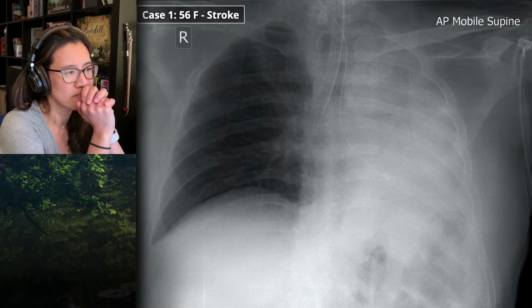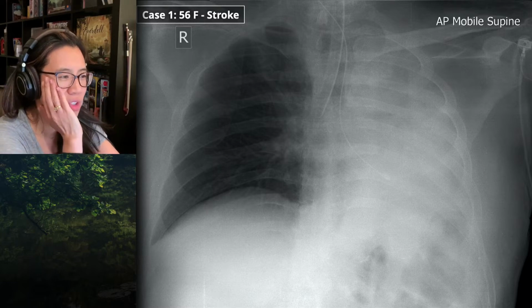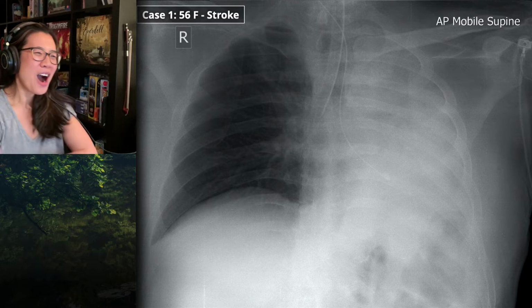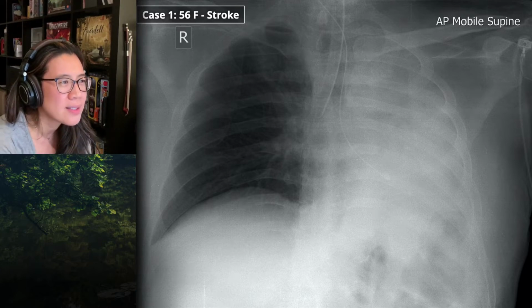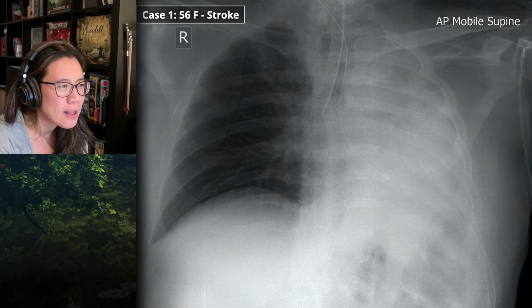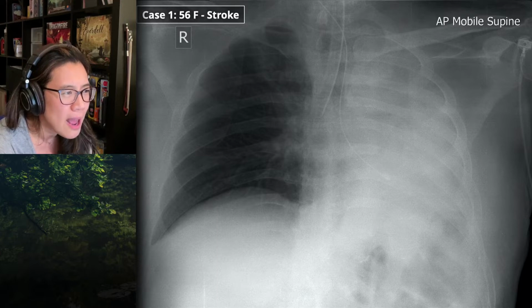Now, the nasogastric tube you said was in the left lower lobe bronchus. How certain are you of that? I wouldn't bet one of my children's kidneys on it. If you look carefully, I'm pretty certain. Okay, so I can see the nasogastric tube up to the level of what I think is the origin of the left main bronchus, which is probably about 1 centimetre from where the ETT ends, and then.